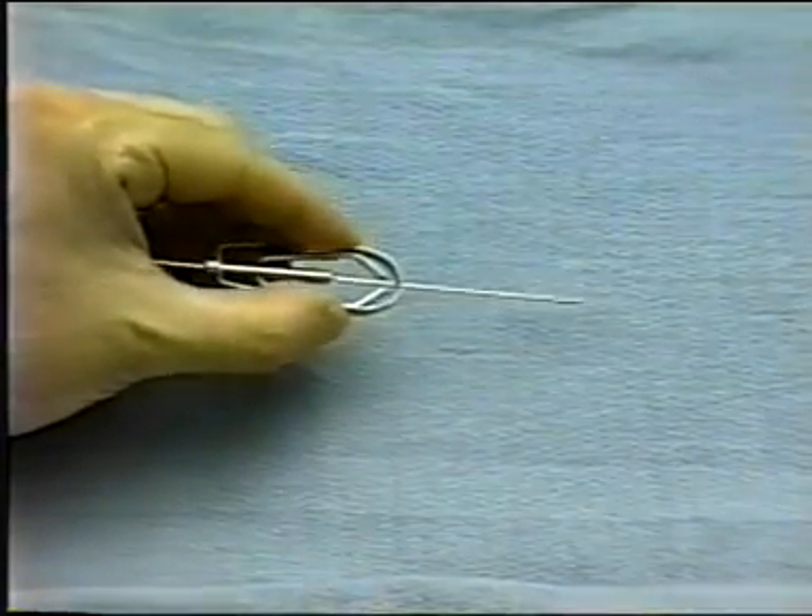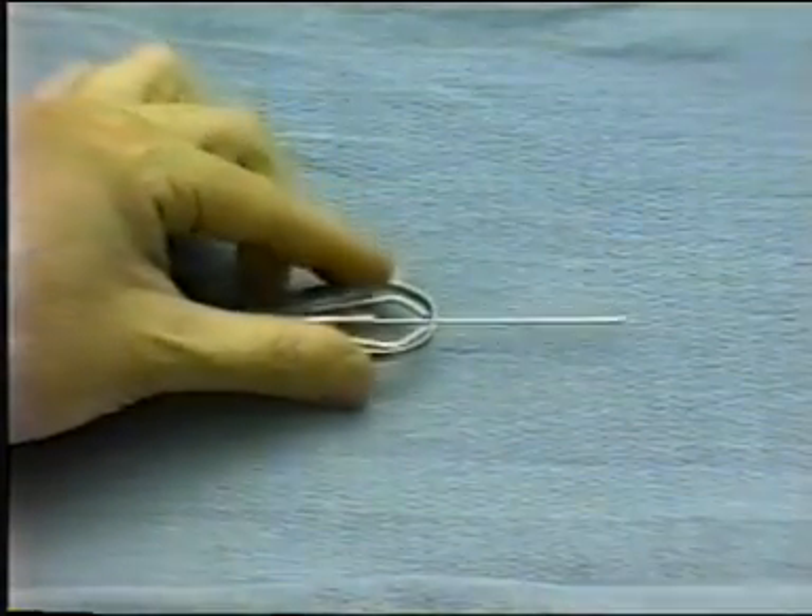You must also have good lighting and magnifying loops, which are essential for this type of repair. The Mini Monoca comes in a sterile single-use pack, as shown here.